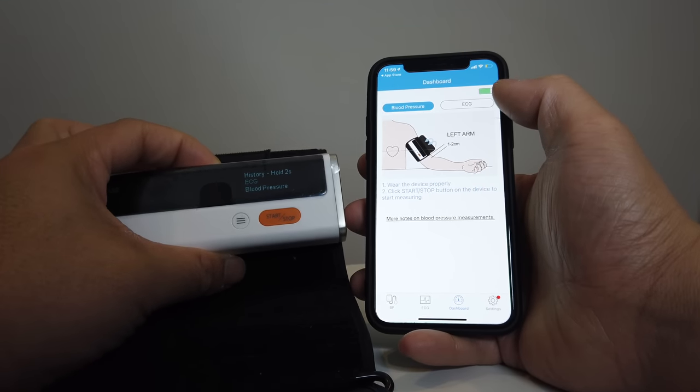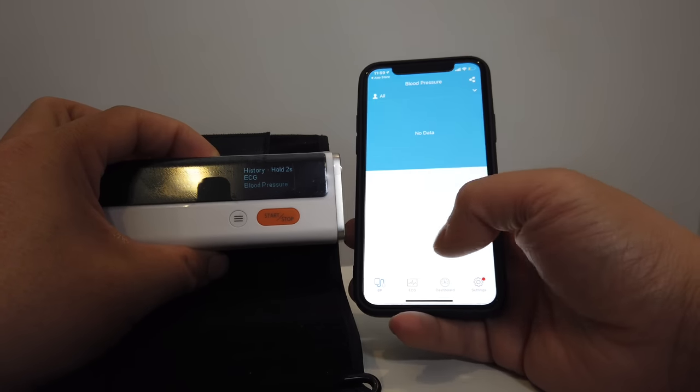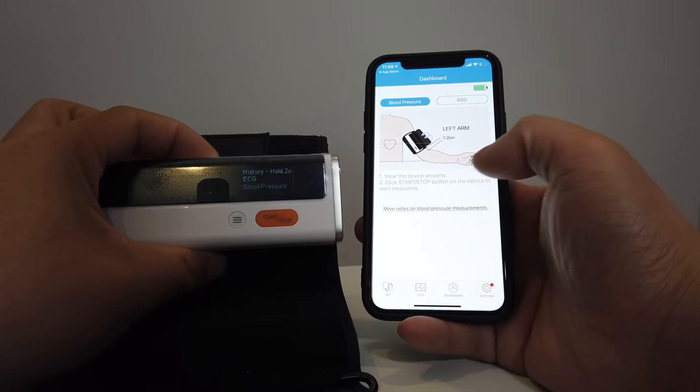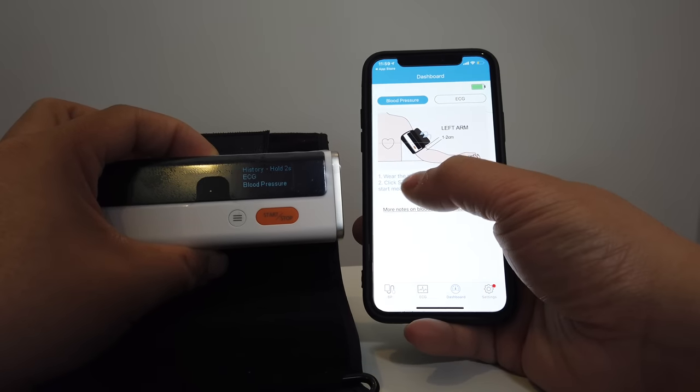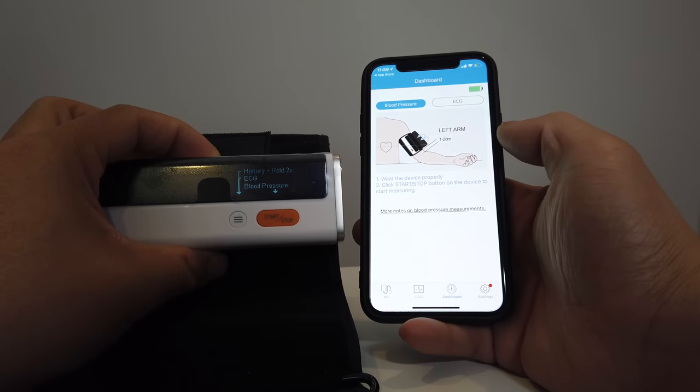It also shows the battery level of the device up here. There's the ECG section and then the blood pressure data as well. It shows you how it works — wear the device properly, click the start button on the device, and start measuring.